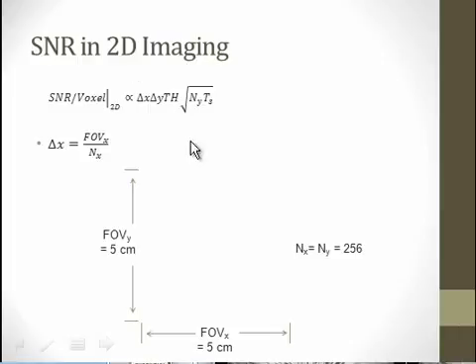And we're also multiplying by the square root of the number of k-space samples in the y direction times TS. And remember, T sub S is the number of samples in X in k-space times delta T. And dx is the field of view X over nx.